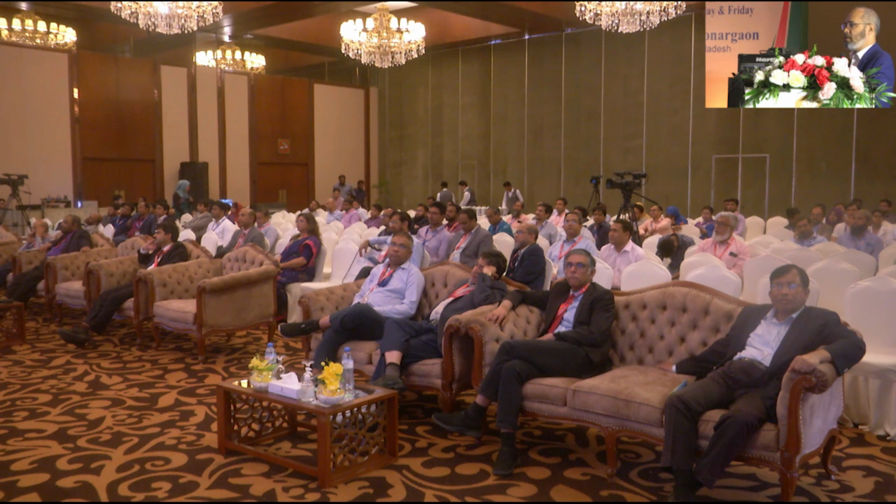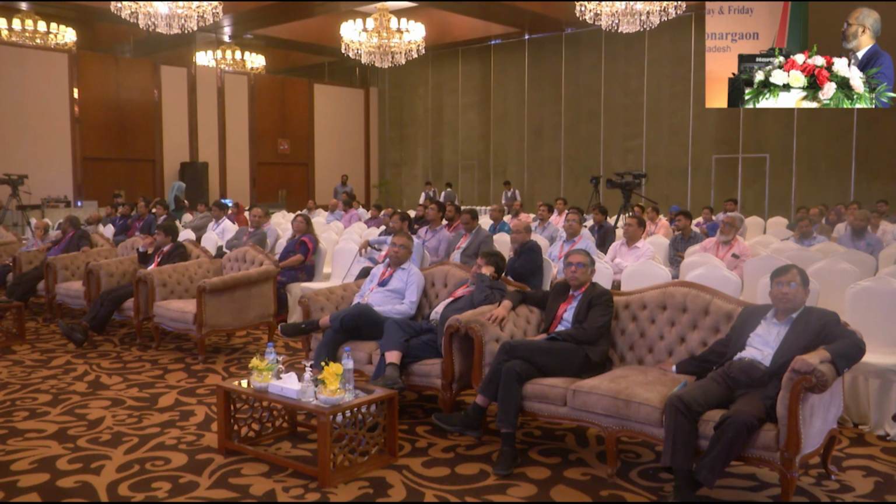And I have with me our intervention fellow, Dr. Avinash. And of course, our team, Dr. Nishit Chandra, who's our Director of Interventional Cardiology and Head of Imaging. We're going to present to you an interesting case. We also have our fellow from Bangladesh, Iqbal, and of course, our support techs.